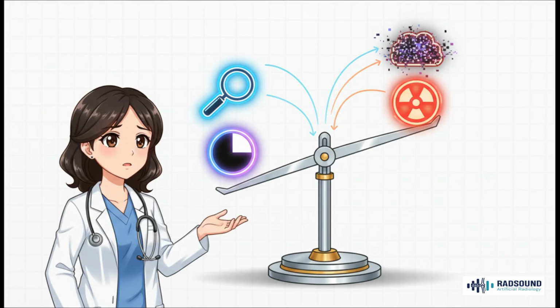Look at how this works. Say you want sharper resolution, so you use smaller pixels. Well, now each pixel catches fewer photons, which means more noise. So how do you fix the noise? You have to crank up the number of photons, and that means a higher dose. What if you want better contrast? You use lower energy X-rays, right? But more of those get absorbed, so you have to increase the dose again just to get a usable image. It is a constant, unavoidable trade-off.